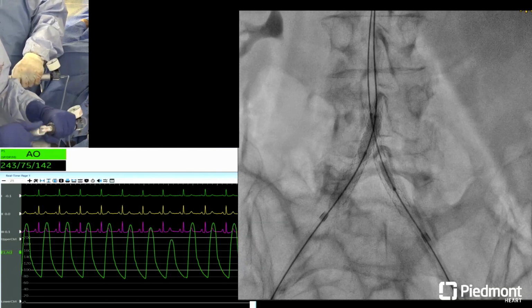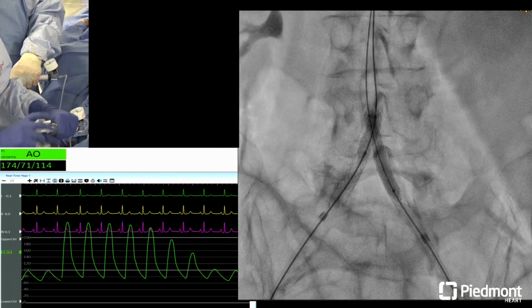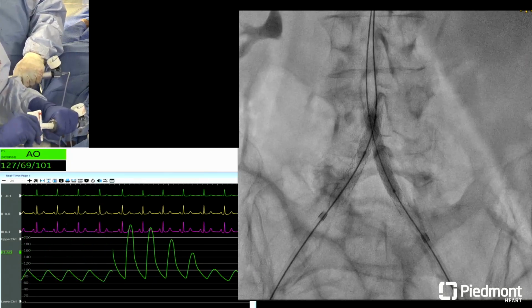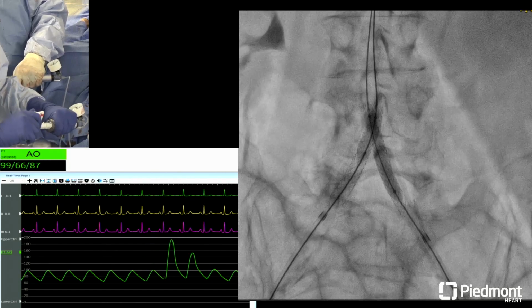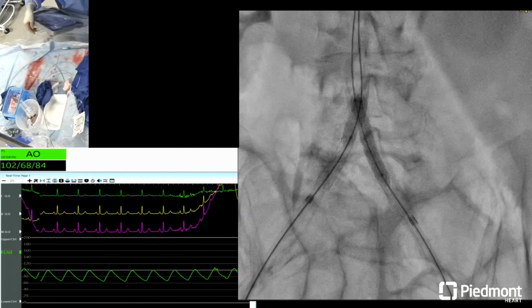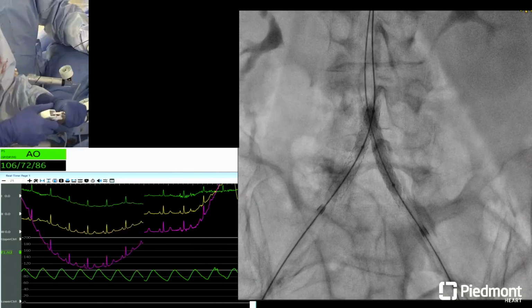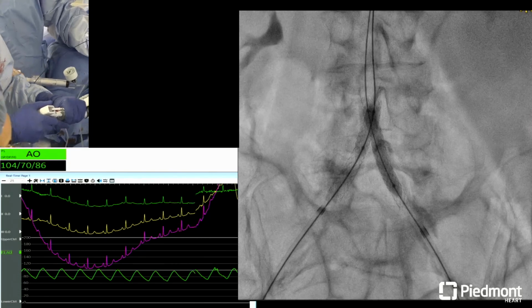You're going to go up higher. I'm at 6. Give me a second. So I think here now, having covered stents, everybody can breathe a little bit. She's going to have a little discomfort. You want to go up to 8? I'm at 8. Okay. I think you were seeing some better expansion there. I know I'm feeling a lot better that that's a covered stent right now, and I usually go to when the patient starts having a little bit of discomfort.